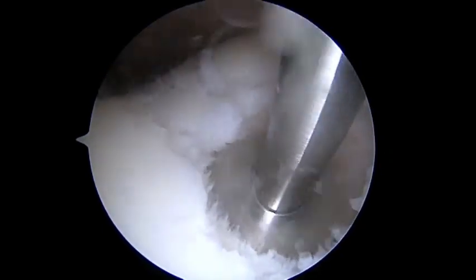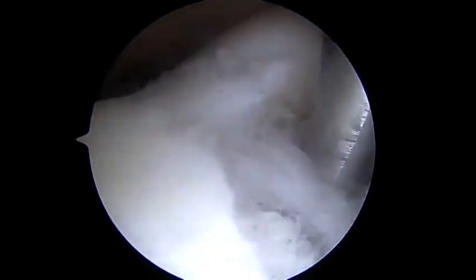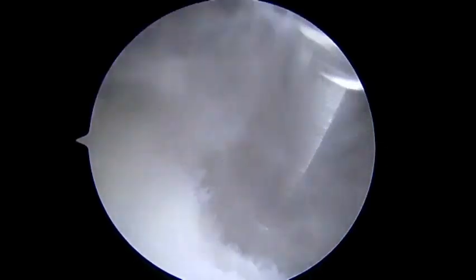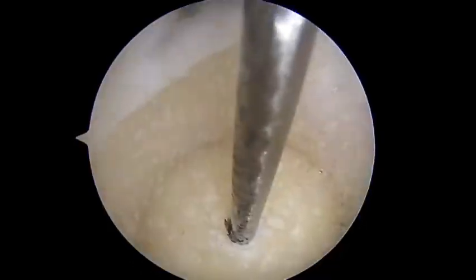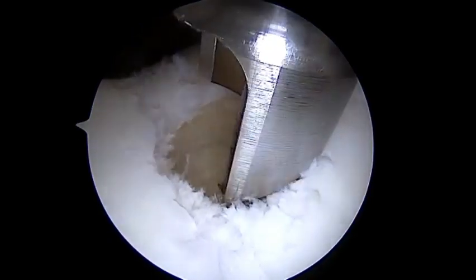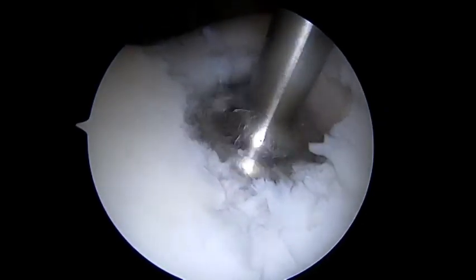And then, as you can see, it's over a guide wire. We're stopping intermittently to assess our depth. We will then measure the depth that's appropriate for the size of the implant, and in this case, using a graft augmentation. There is a second reamer, which is a coring reamer. Again, the flutes are designed to cut the bone and create a circular osteotomy for access of deeper marrow and to clear the bone efficiently as to not impact this.